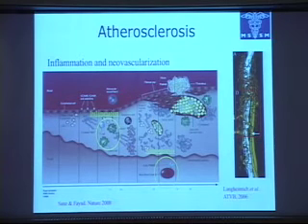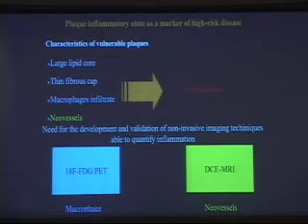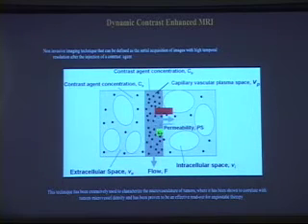So let's talk a little bit about angiogenesis and what you can do with angiogenesis measurement. One of the things you could easily do is use this dynamic contrast MRI technique. This is a technique where you inject the contrast agent, such as gadolinium, intravenously, and then you follow the uptake. You could use two-compartmental modeling to follow what's going on.